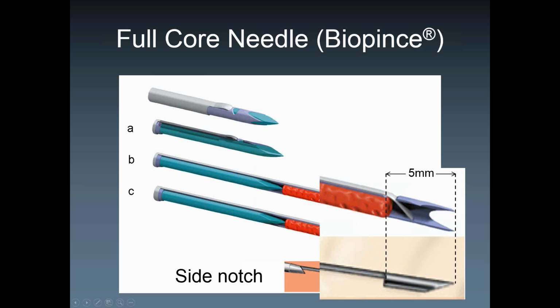That's important to notice. Both devices at the very distal end, the distal 5 millimeters, don't carry any tissue, but they traumatize the patient. That's important to keep in mind. For large targets, no big deal, because you have enough tissue in here. But for small targets, you have to keep that in mind. But you usually want to fire through the target. Let's say a small met in the liver, you can fire through if there's nothing at risk behind that target. But if it's sitting right on top of the portal vein, for example, or an artery or, more importantly, a bile duct, you don't want to fire through that. Okay.